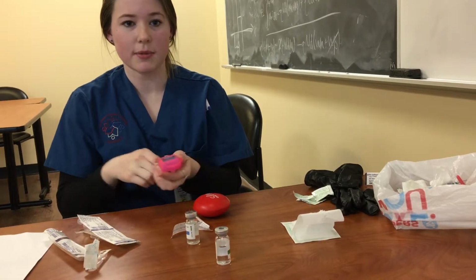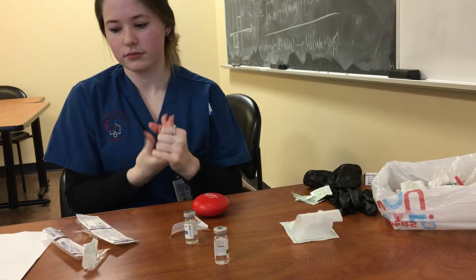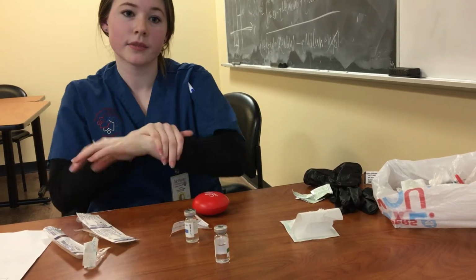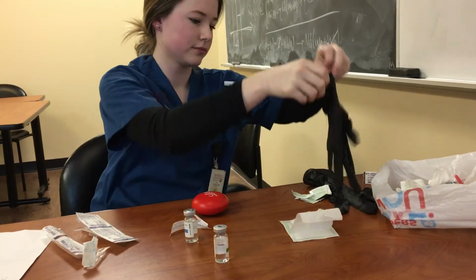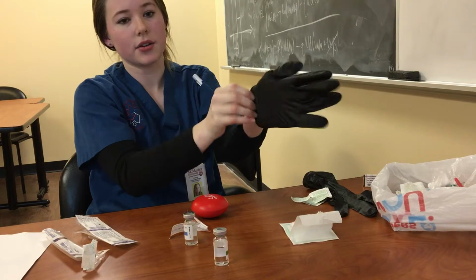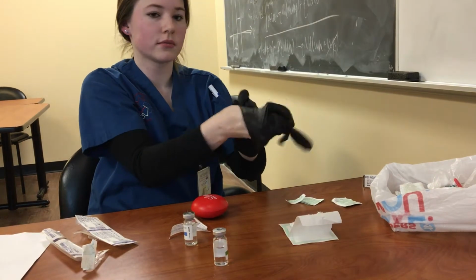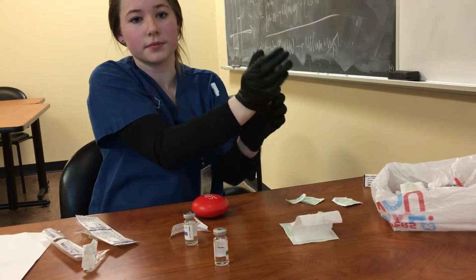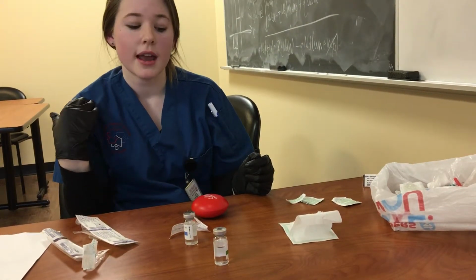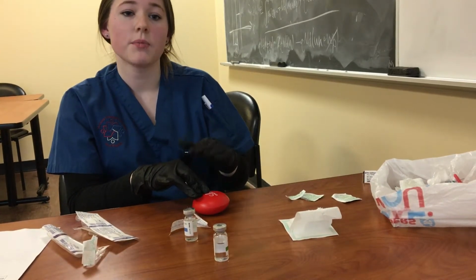But like always, I want to begin with my hand hygiene, followed by putting on some gloves. And now this IM injection will be given at a 90-degree angle, like all intramuscular injections are. The difference in this one being the landmarking. So I want to locate the clavicle and move up to the acromion. And from the acromion, I want to go about 2 to 3 finger widths down on the patient's deltoid. So I'm right in the middle of the deltoid.